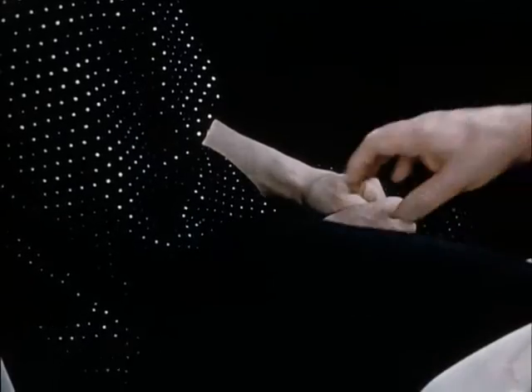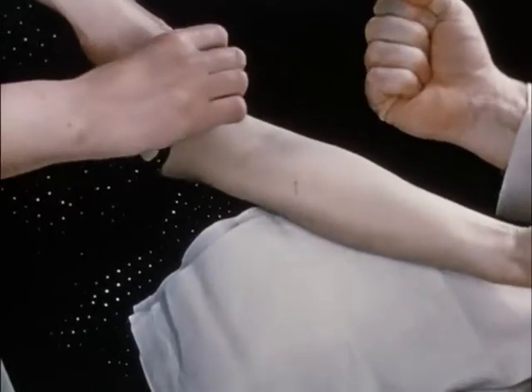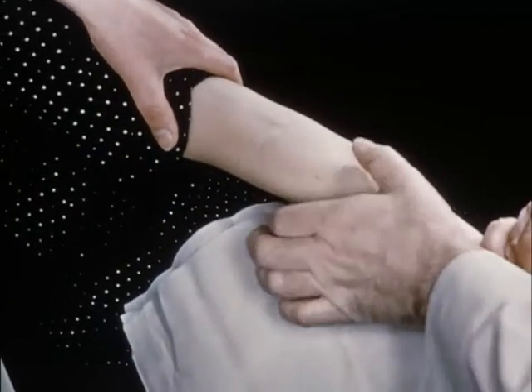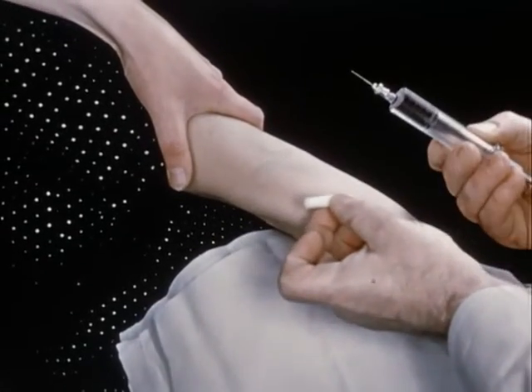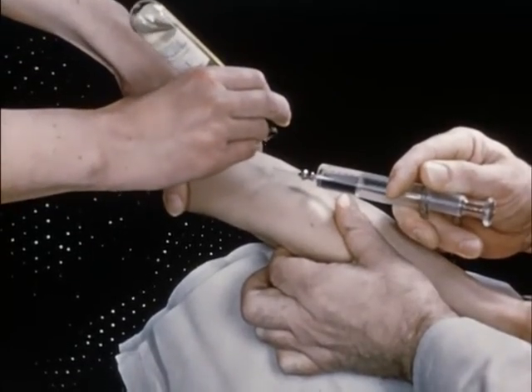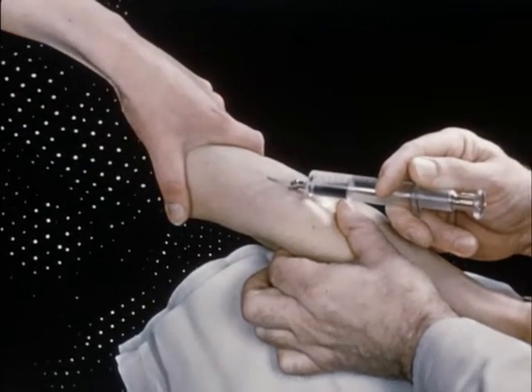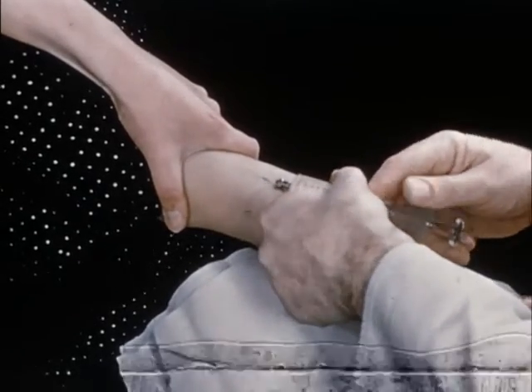Each year, the importance of the intravenous route for drug administration is emphasised. This route is of special value to the general practitioner for the injection of small amounts of solution or the withdrawal of blood samples. One example used here is the administration of a few millilitres of anaesthetic solution to the ambulatory patient. The main object of this film is to show how venipuncture can be practised in safety without risk of perivenous infiltration, arterial injection or other local complications. The simple equipment necessary to a consistently safe technique will also be discussed.